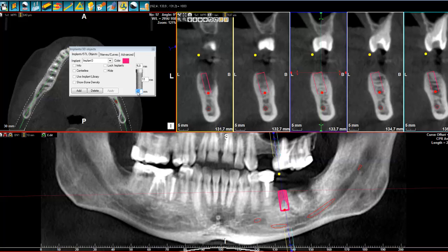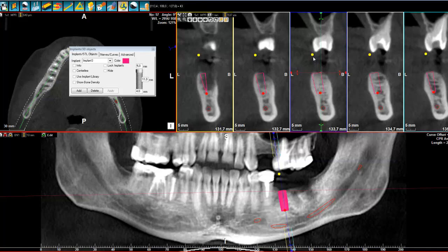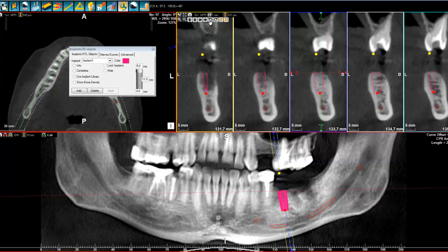The orientation is still not right — I did that on purpose — so I can simply come here and change it. If I want to be more precise, I can apply the controls. You can see that the icons that used to be useful for the views are now dedicated for implants. In my view, I can turn degree by degree or move below millimeter precision, so like this I can get maximum precision for my implant.